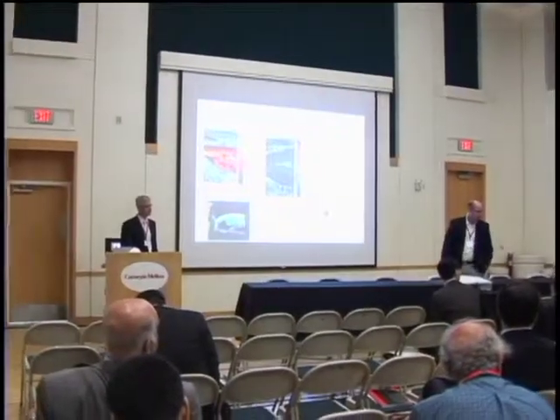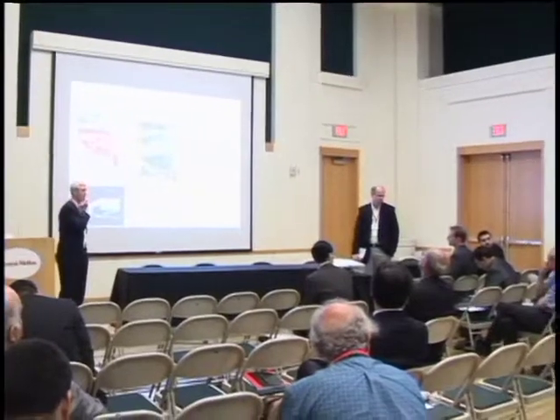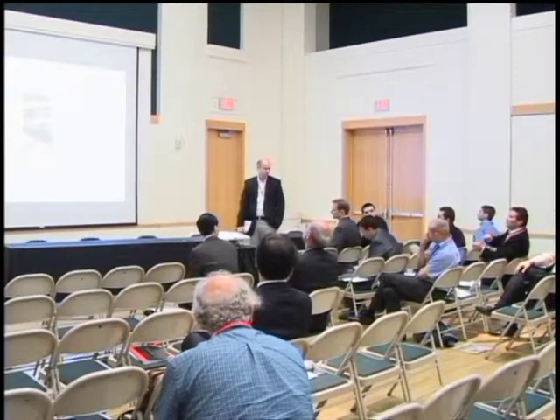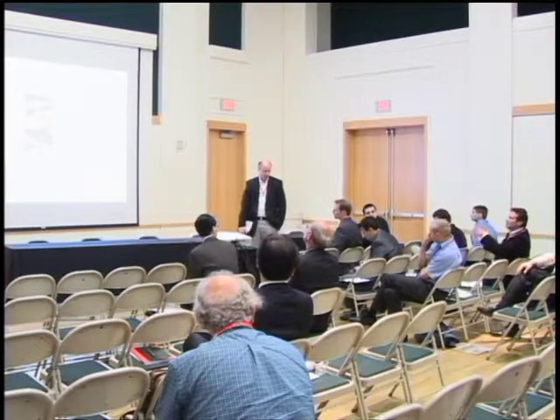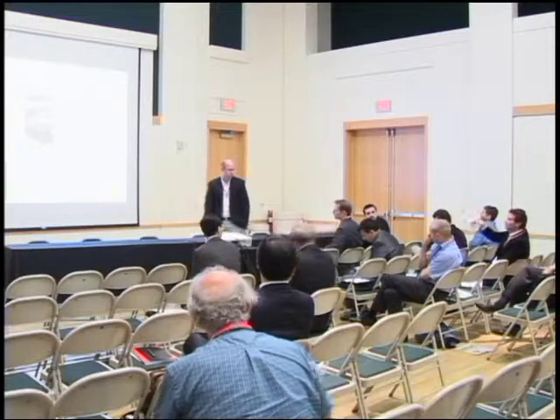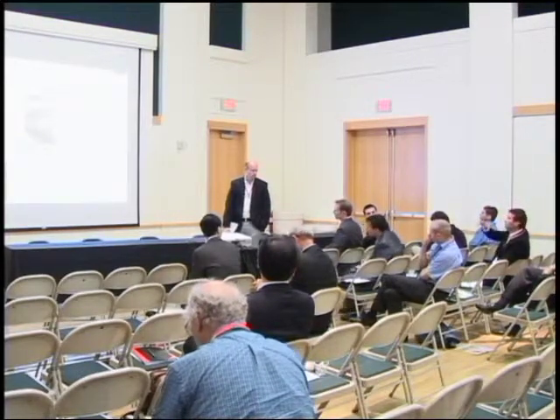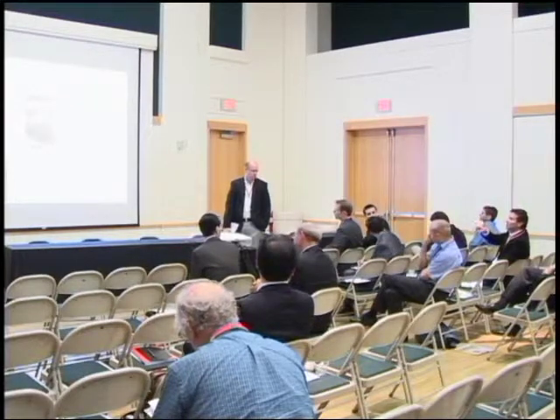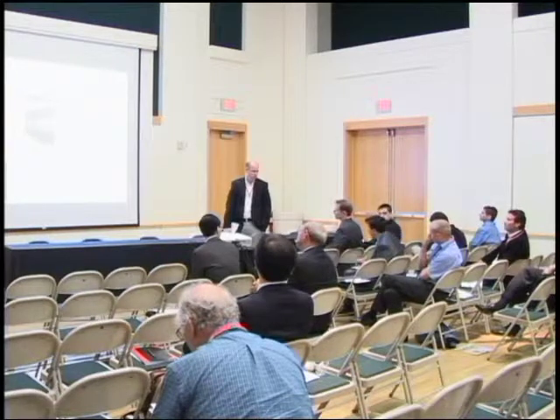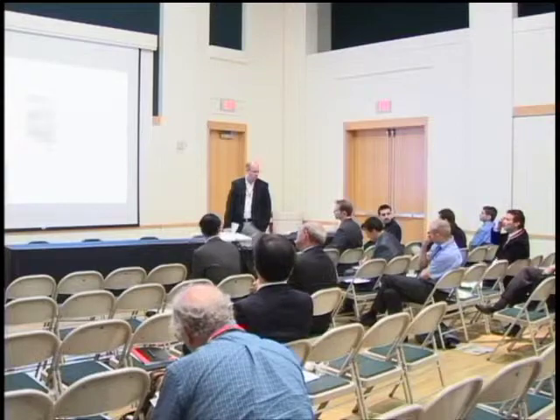Jørgen, you say that you should be able from the velocity to go back to pressure. Yeah. You know that there is mixing in pressure, velocity, and sometimes elasticities, arterial elasticity. But here, as you've got all the vector flow, all this information, perhaps just by checking the way your vortices are going to be created, you could have access to pressure without being corrupted by arterial elasticity.